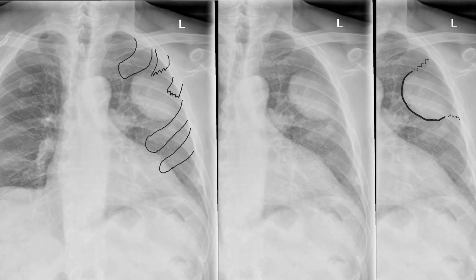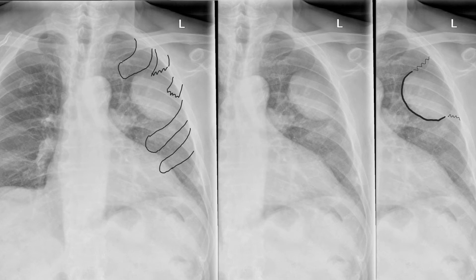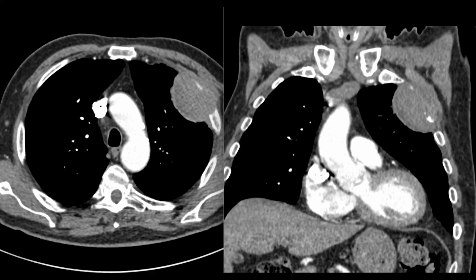Note also that the ribs have gone anteriorly, and this makes it an extra-pulmonary lesion, but it's also an extra-pleural lesion because of the rib destruction. Here is the CT that demonstrates the rib destruction.